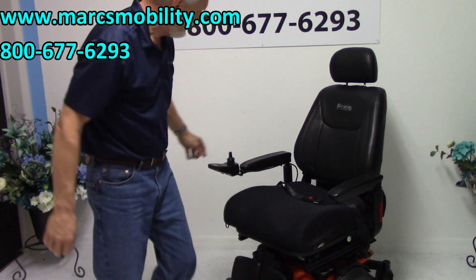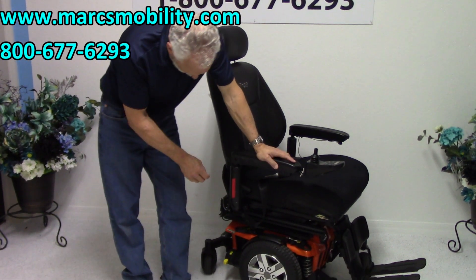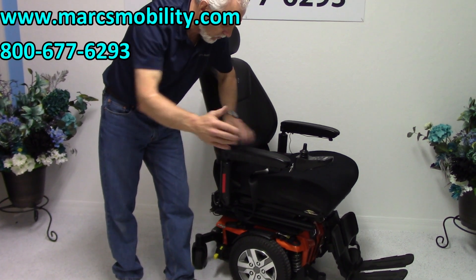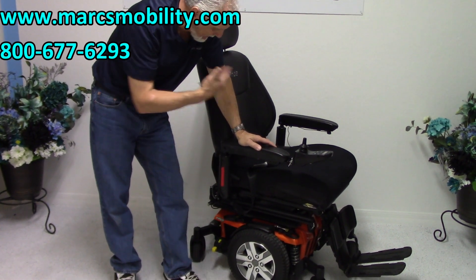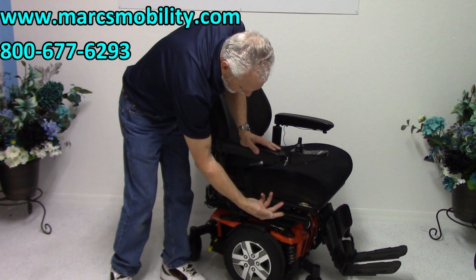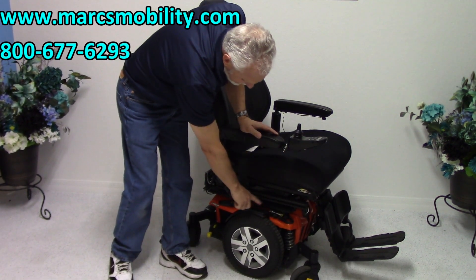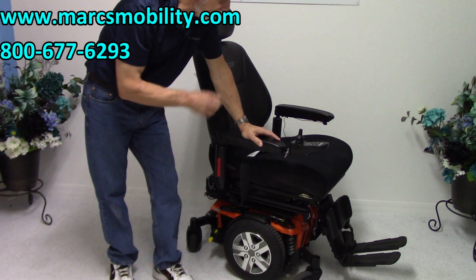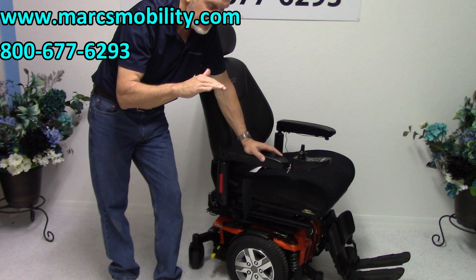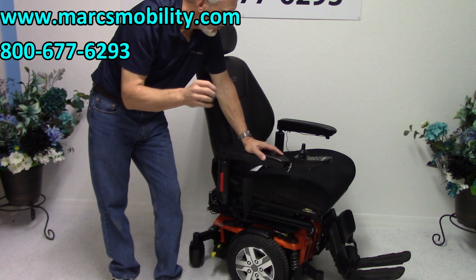So again, this is the Quantum Edge 2.0 I-Level with the 21 by 21 seat — large seat, captain's seat, adjustable back, adjustable arms, solid tires, anchor points, safety belt, adjustable manual legs, and the full light kit. This is a really nice chair if you need a 12-inch seat lift and you want the Quantum, but you don't want to spend thousands of dollars. This one's available.